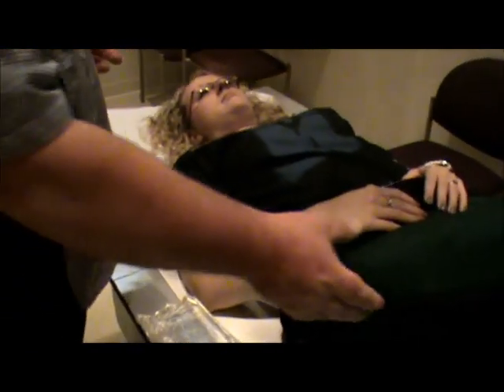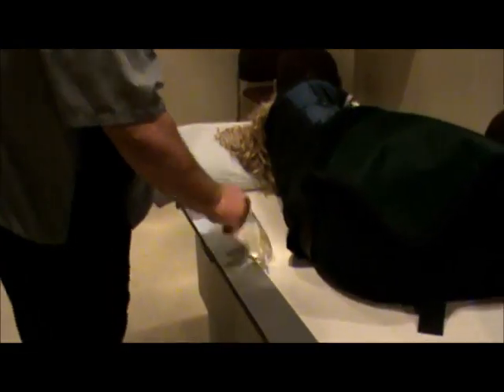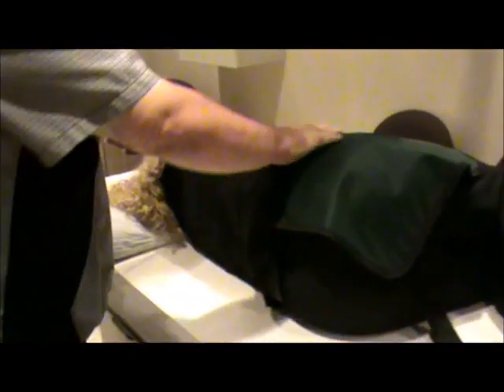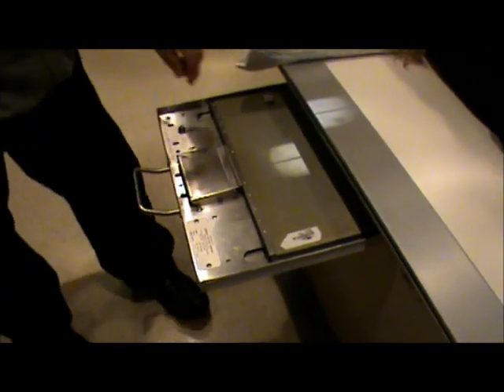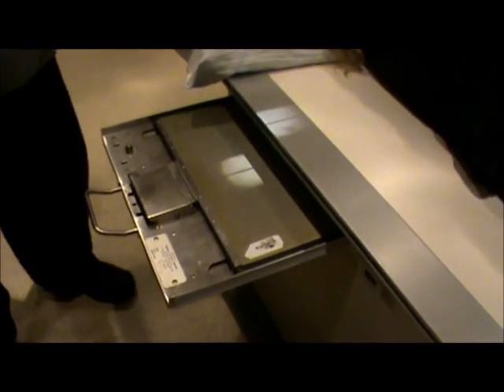Now we're going to have the patient roll up onto their left side. We'll put the shield across the patient. We do want to make sure the patient is in a good true lateral — you can see she's rotated a little bit, so we'll push her hips forward. I run my hand down the back to verify the patient is indeed straight. Film size is 14 by 17 lengthwise.